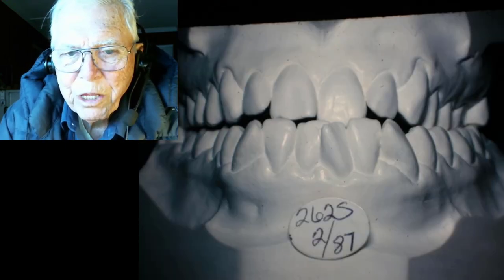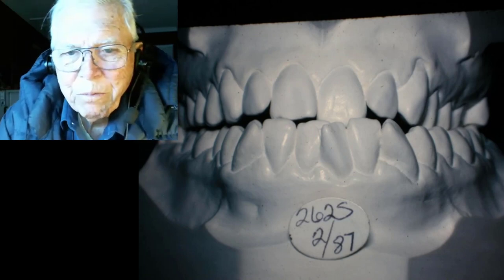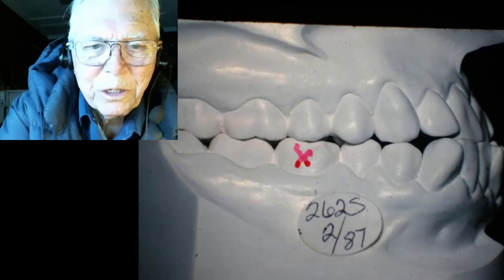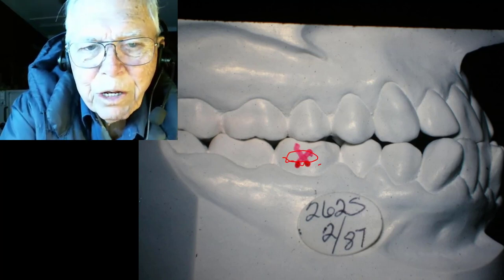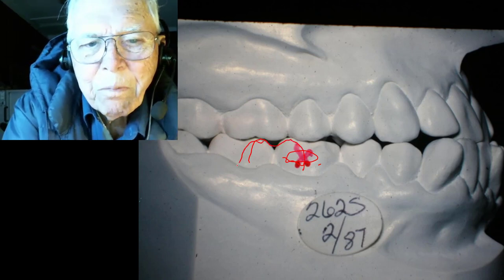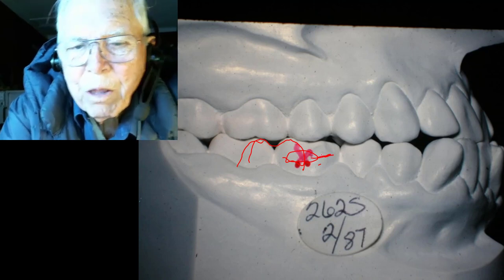We used a lip bumper to move the upper teeth forward a little, and we pulled the lower teeth back. By using Class 3 elastics on the upper to some extent — I don't show those here — but that's what we did. Looking at her teeth, there's no question about it being a Class 3. You can see this six-year molar is way up here — it's about that far Class 3.